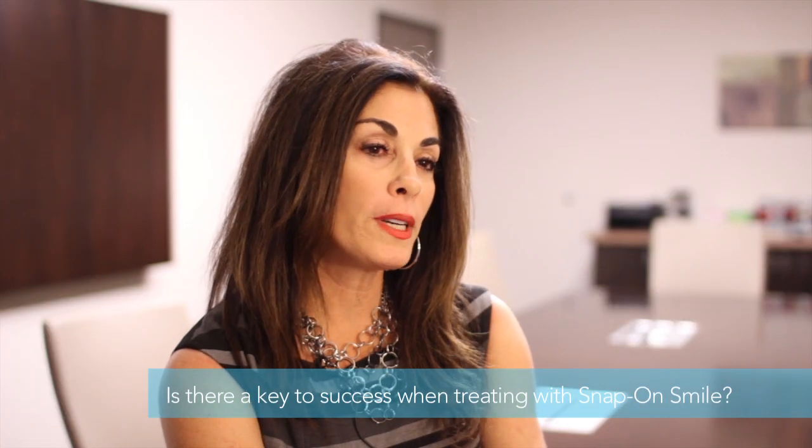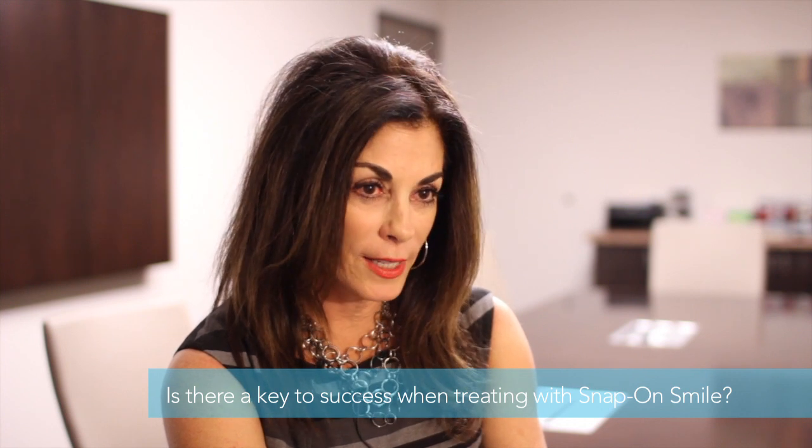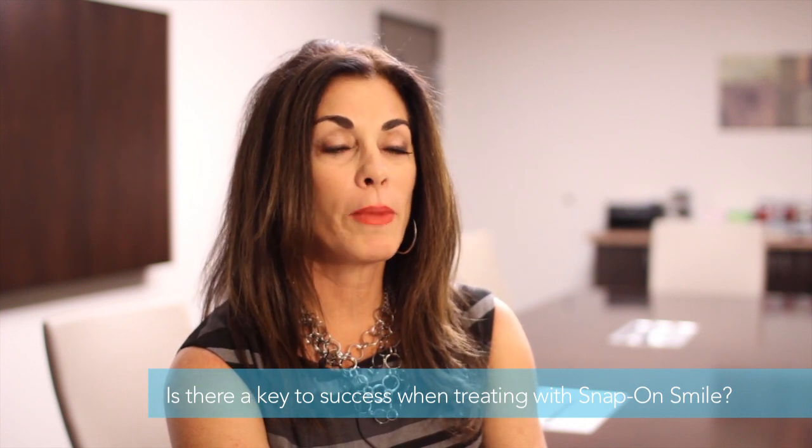One of the most important things I would like to relay to the dentist is to make sure the impressions are accurate. Just like you would on crown and bridge, when you send it to your lab, no voids, no tears. You have to make sure that everything you're doing on your end is going to allow the lab to make a consistent, superior appliance that's going to make your patient walk out happy.